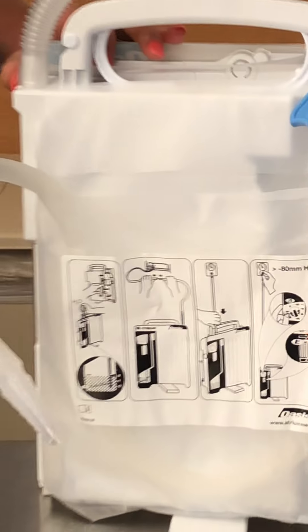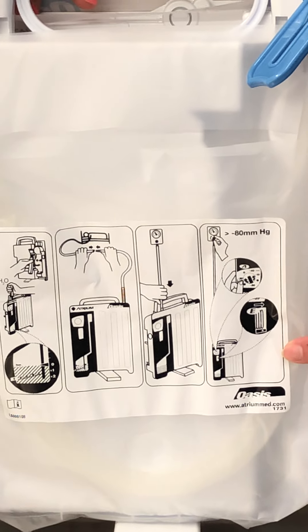On the back here, there is a little tutorial. If you forget how to set the chest tube up, right here it tells you step by step what you need to do.